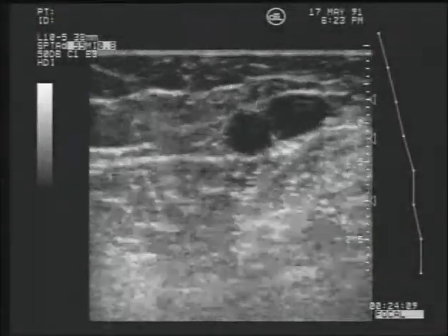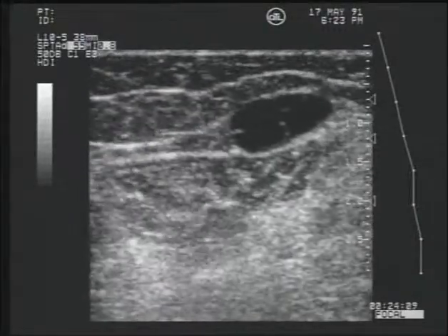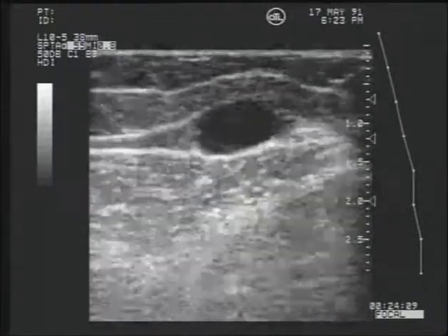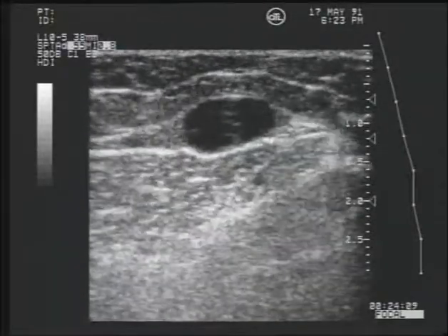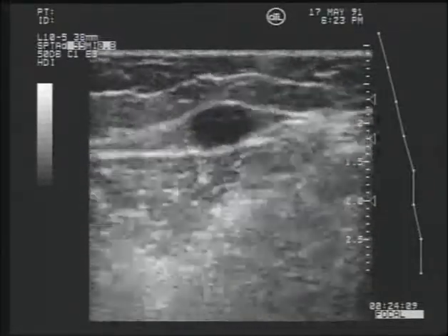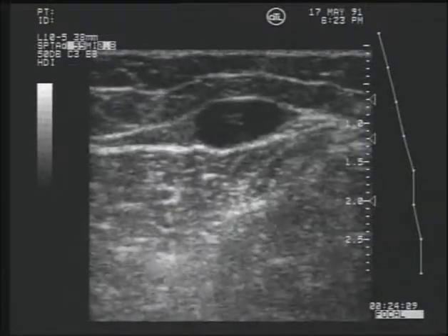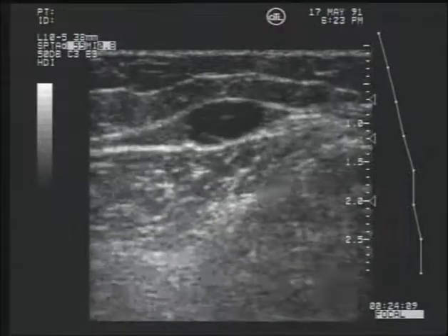The other non-thrombotic structures commonly seen within the lumen of the vein are venous valves. They appear as very thin, delicate projections into the vessel. They are brightly echogenic, but because they are so thin, they can easily be overlooked during venous imaging examination. They present a problem only when they are mistaken for non-obstructive thrombus along the vein wall. When a valve is encountered during transverse scanning, it will appear as a thin white line, usually in motion, that appears within the lumen of the vessel.